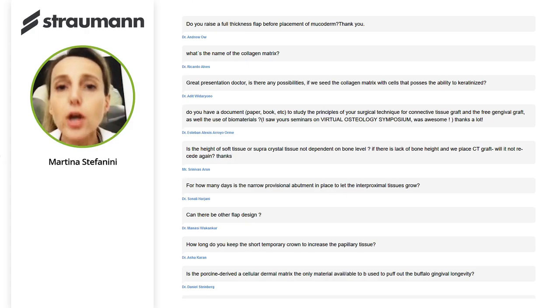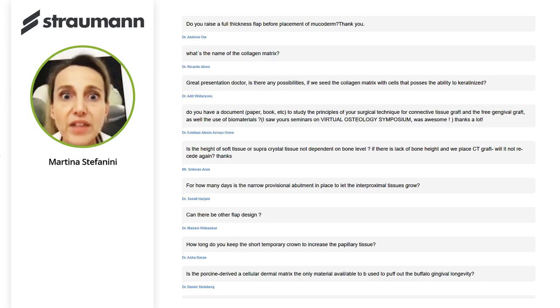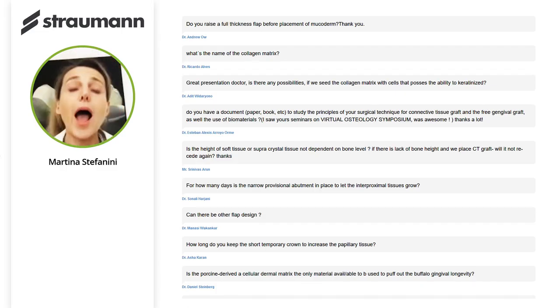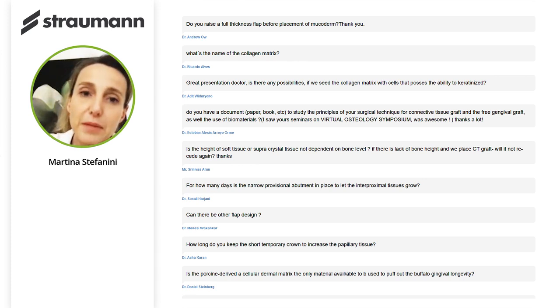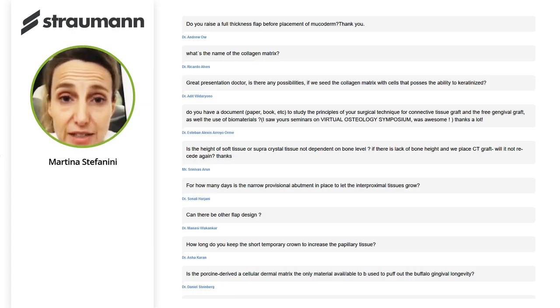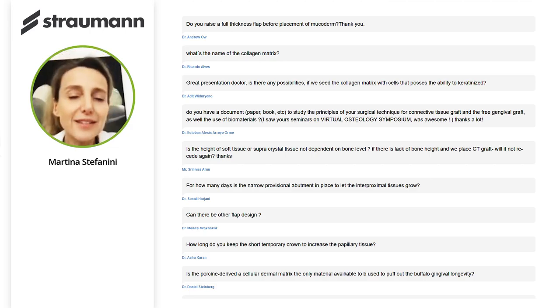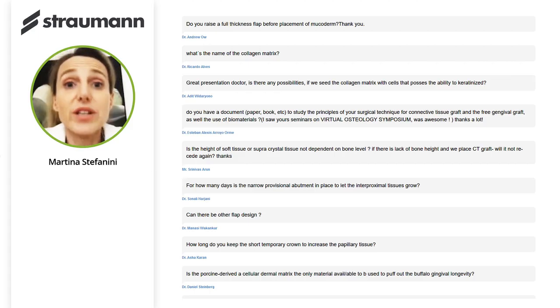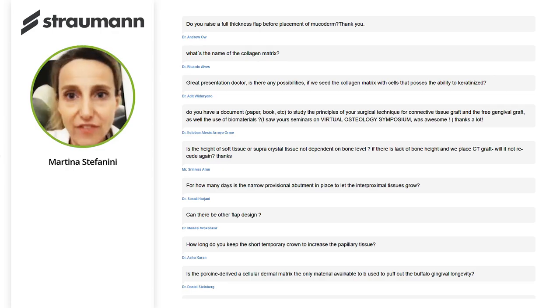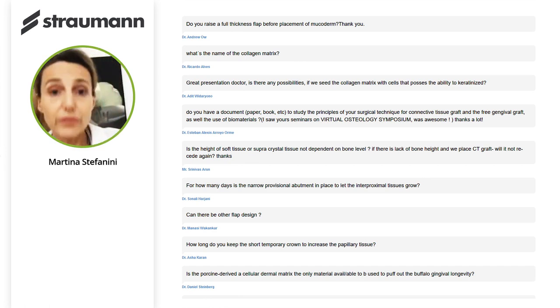When I coronally advance a flap to treat a gingival recession around teeth, I always elevate full thickness, inserting the periosteum elevator inside the sulcus, and I elevate full thickness the flap up to 3 millimeters on the buccal bone crest, because this central portion of the flap will be coronally advanced and will cover the avascular root area, while the surgical papilla will be positioned above the anatomic desepithelialized one, and they will receive vascular supply from them, while the central portion of the flap will not receive any vascular supply from the underlying tissue because it is hard and avascular in both treatments, teeth and dental implants.